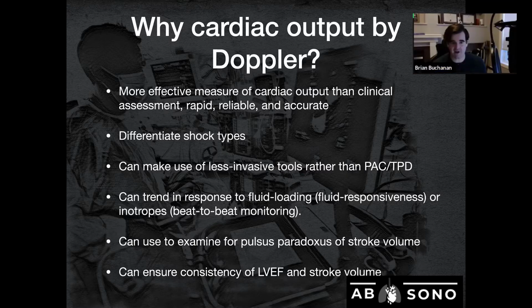Yeah, I would agree. If you do this well, if you acquire it well, with a nice clear angle and a good waveform, you have a really solid objective measurement of what that output is like, right? So I think one of the main benefits is just the fact that it's reliable and accurate, and if you can do it well, then it is really helpful at the point of care.